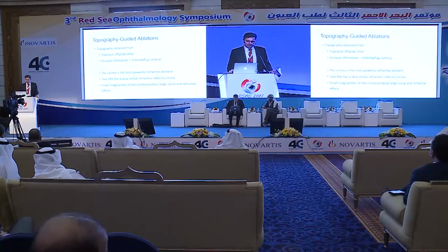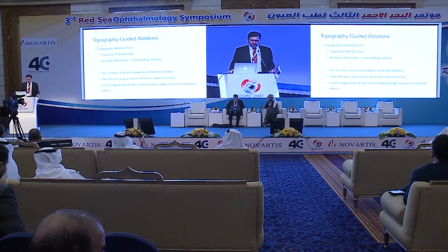So as Marsden Sinjab said earlier this morning, when you're doing a topography-guided procedure, you have to bear that in mind and think about that when you make your flap. As far as topographies go, these are two very powerful diagnostic devices. They're two powerful therapeutic devices, and they integrate very well into WaveNet. So the information comes off these two devices, and we now want to make a decision of how to use them. The topo-guided part is primarily to regularize the cornea, and it might also address angle kappa.